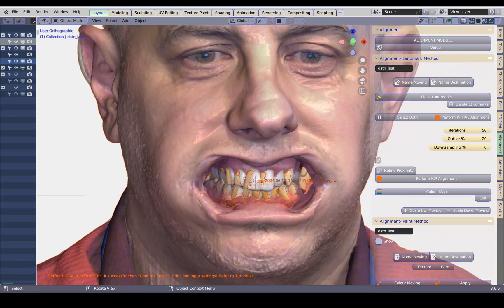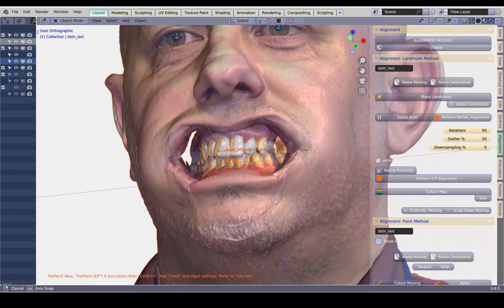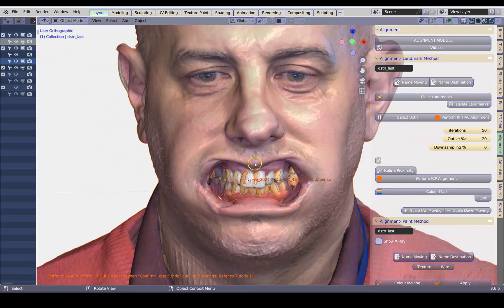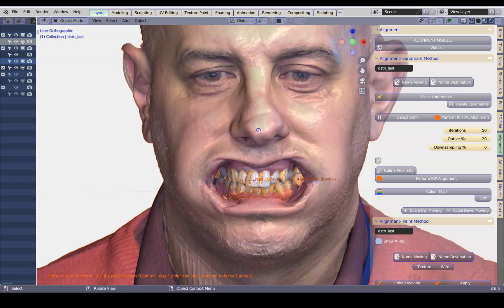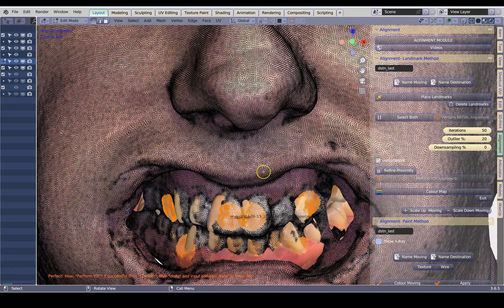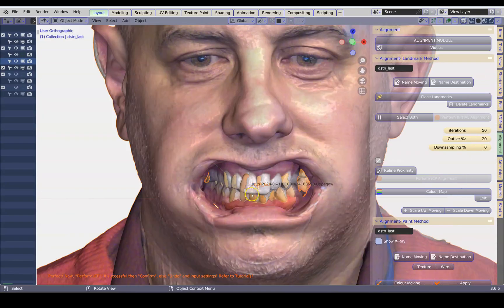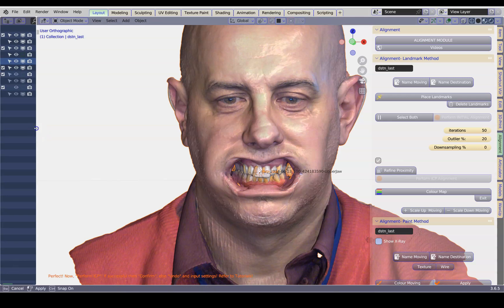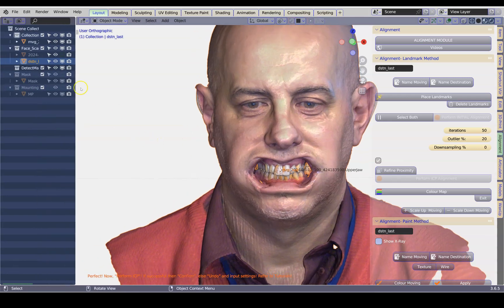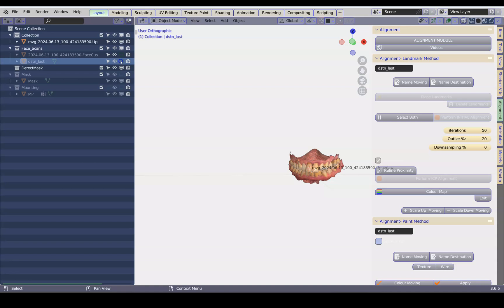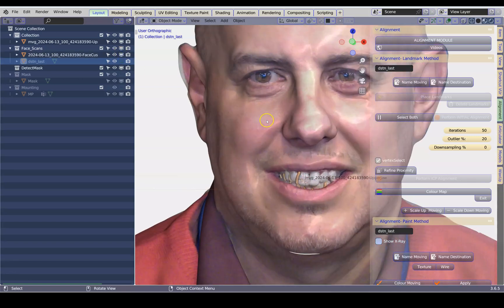Now we've got the alignment of the teeth. Just check that you are more or less happy with it, but sometimes there can be a little bit of deviation because these facial scans — the mesh structure is not so good. You can actually see the mesh structure if you go into edit mode — it's not such a great structure, but it's good enough for this purpose. The next part we want to cut out the teeth, so I'm going to move to the other model. We've used this one for ICP alignment; now we want to use this model.